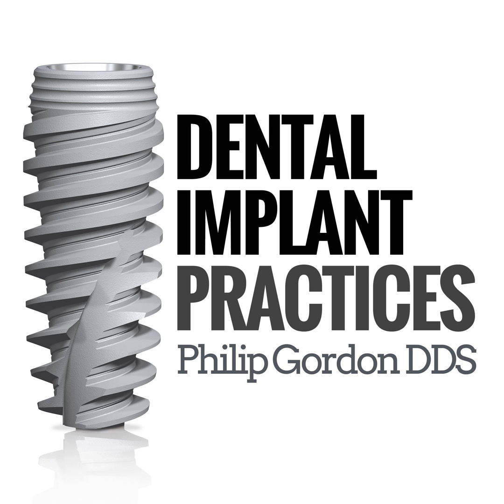So this went along for a few years, and then the head engineer for Steri-Oss, Denar, Steve Herson, said, we're getting a lot of radiographs, and they're not losing any bone. The 4mm collar needs to be shrunk. It needs to be cut down to 2mm, because we can't make shorter implants. The shortest implant we had was 12. There were 16 and 12, so we could then go 16, 14, 12, and 10. That went along, and people liked the simplicity. We had a very simple kit.